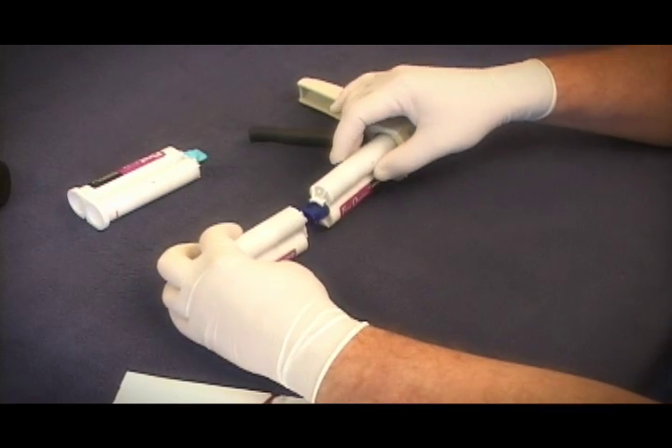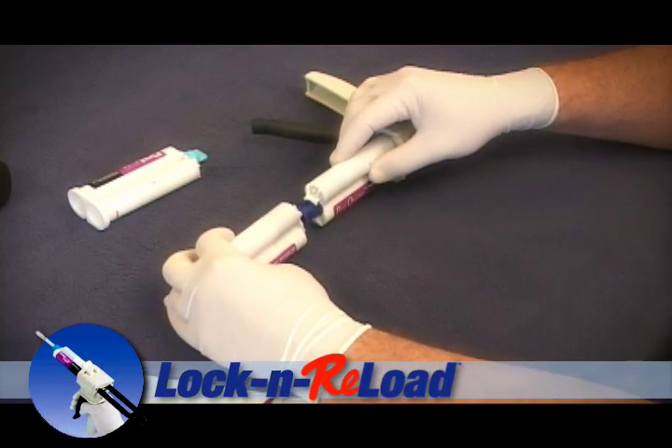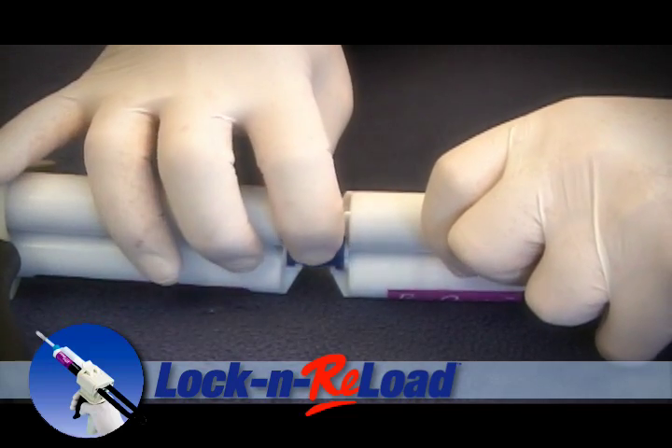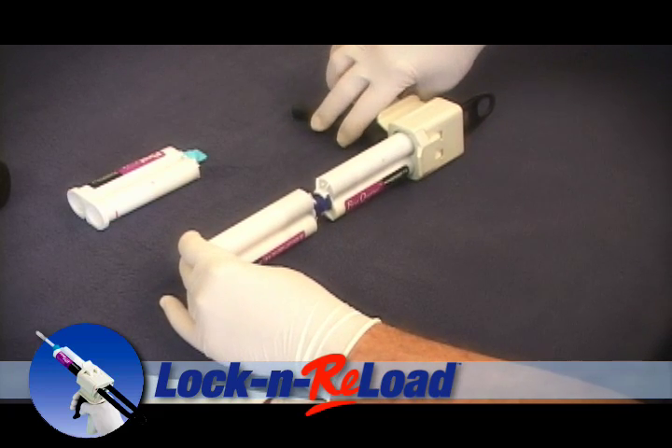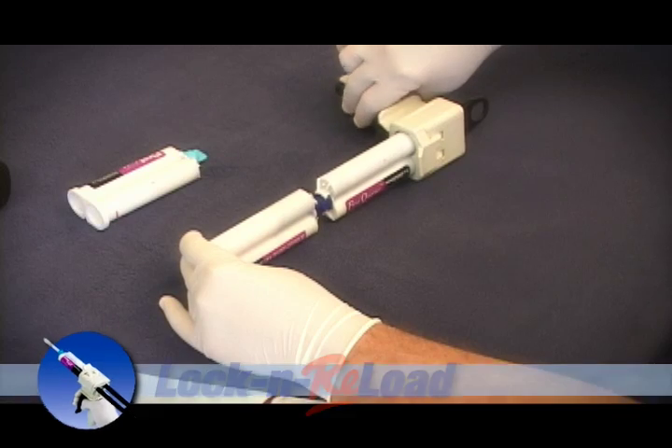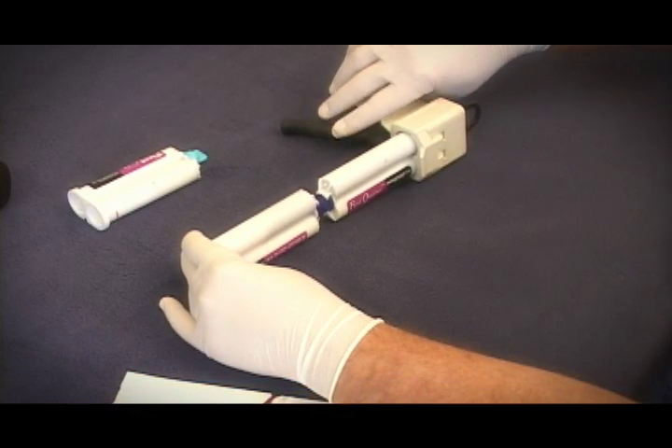Line up the labels — most manufacturers' labels line up the same way. Turn the coupler in the direction of the arrow to lock them in place. Once the cartridges are locked in place, you can begin transferring the liquid from one cartridge to the other. Once the donor is empty, lift up the cover.